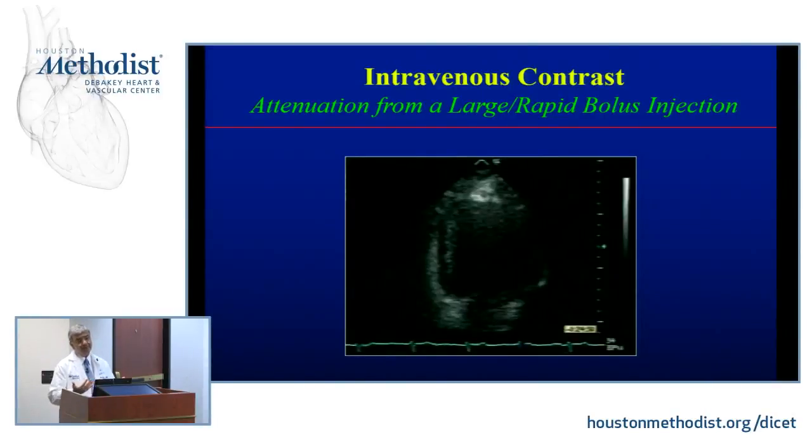Well, turns out what happens is if you have a lot of concentration of microbubbles in a beaker, it acts as a very super duper reflectant. So from the first interface, you reflect most of the ultrasound and you're not going to be able to penetrate. And if I cannot penetrate a certain surface, I'm not going to be able to reflect anything back. And what happens over time is if you expose this medium to a lot of this ultrasound, interestingly enough, you start destroying some of these bubbles, and once the destruction is enough and you can penetrate, then you can start seeing. Now, do we see this phenomenon in humans?